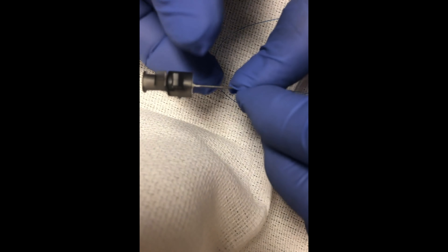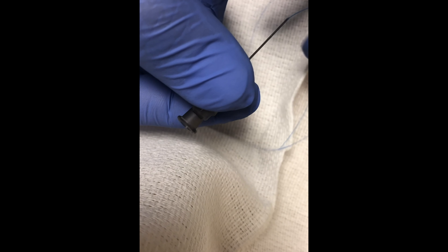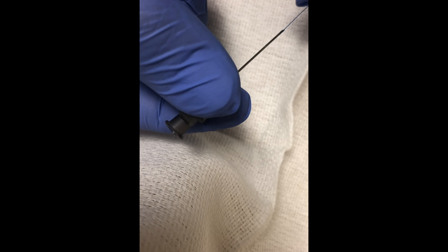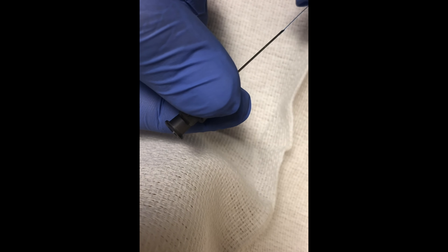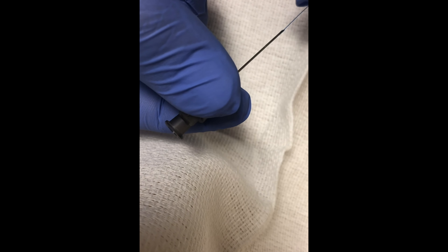You're doing good aseptic wound care and you want to close a wound but you're without proper suture material. One way to close an uncomplicated wound is with a beveled needle and thread — a sterilized cotton thread, a paracord thread, or even thin nylon fishing line.